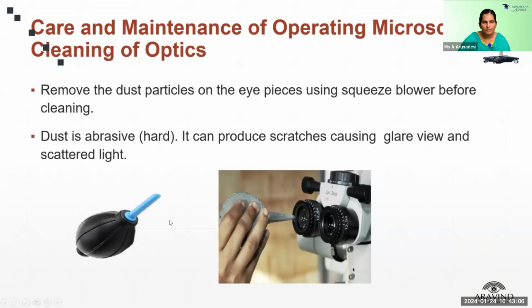Cleaning of optics. Dust is abrasive, so it can cause scratches, which lead to glare and a scattered view. To avoid this, always clean the optics using a squeeze blower.